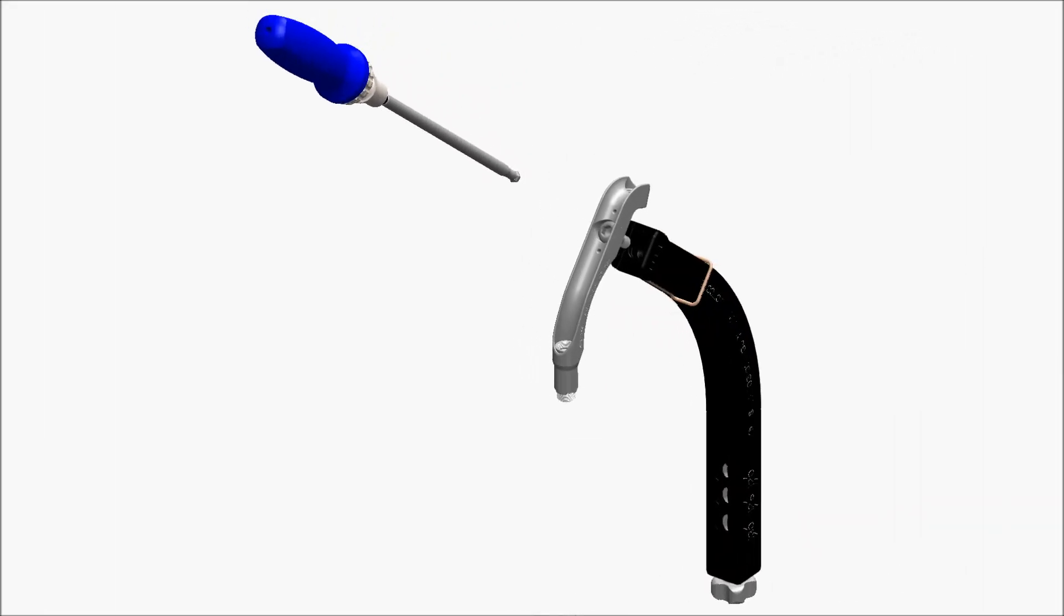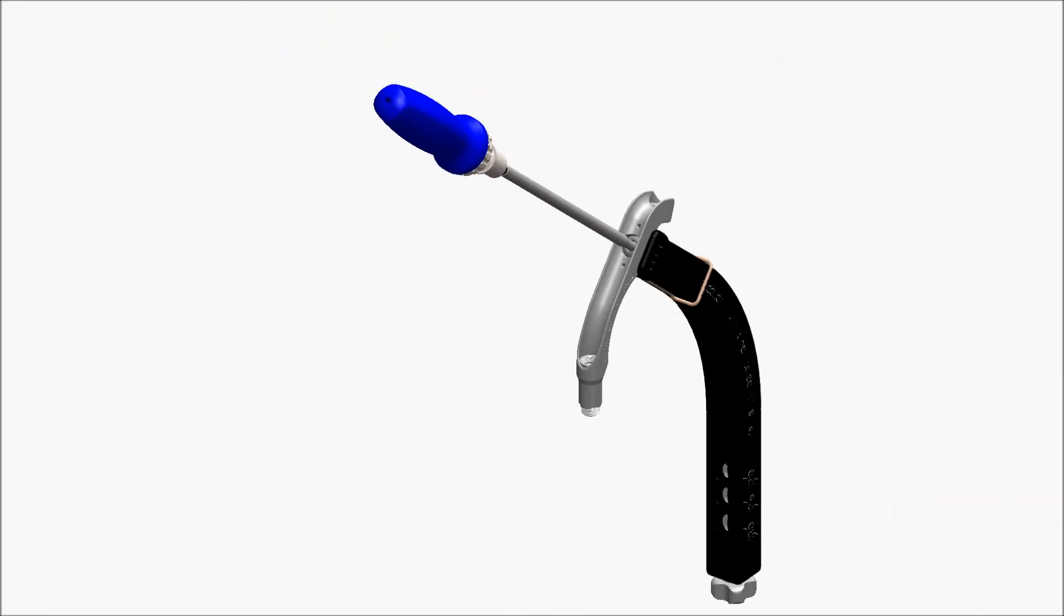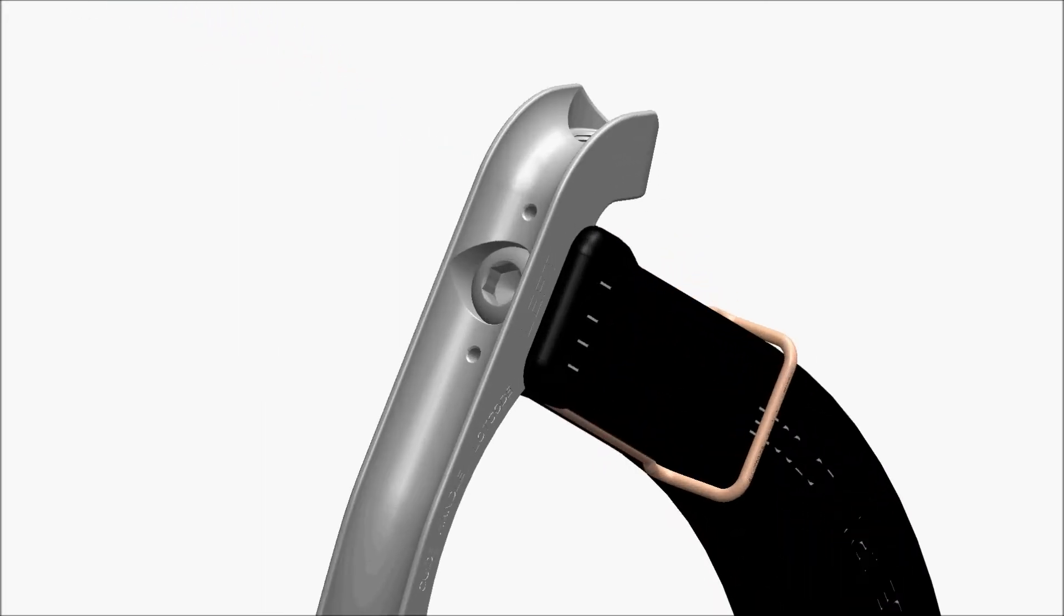Assemble the guide arm. Be sure to securely tighten the connecting screw. Confirm that the goal posts slide easily through the guide arm.